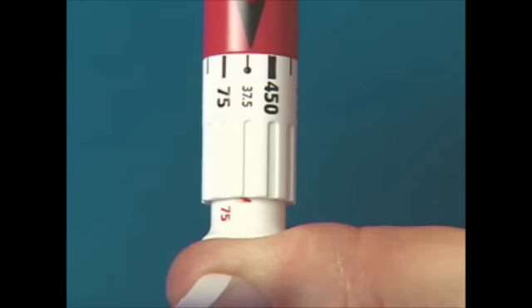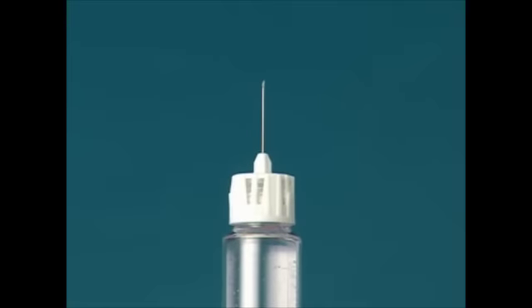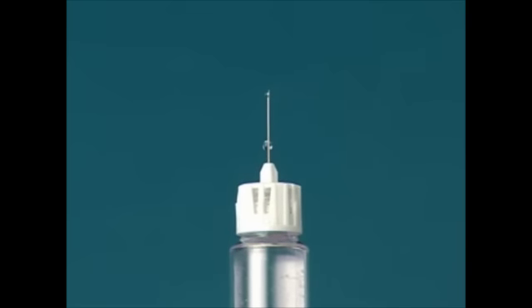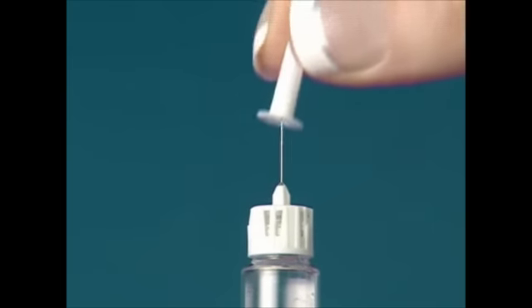Keep the needle pointing upward and push in the injection button completely. Hold until you hear a click. A small amount of liquid should appear from the needle tip, which means the pen is now primed and ready for use. If no liquid appears, re-prime the pen until it does. Replace the inner needle cap.